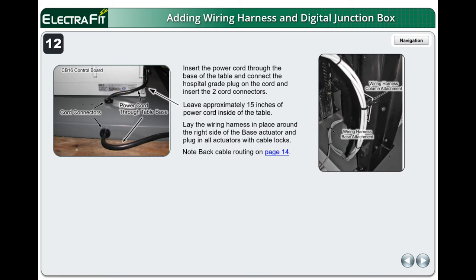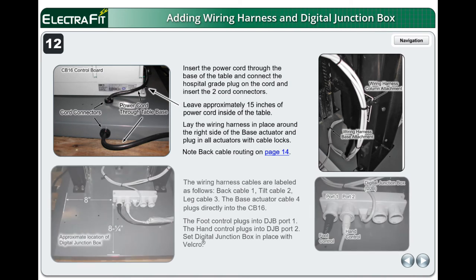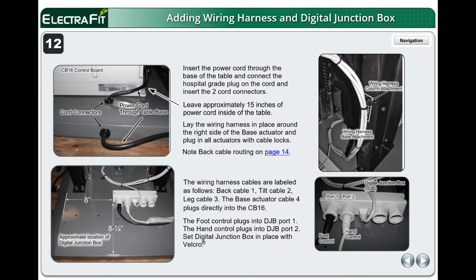Lay the wiring harness in place around the right side of the base actuator and plug in all actuators with cable locks. Note back cable routing on page 14. The wiring harness cables are labeled as follows: back cable 1, tilt cable 2, leg cable 3. The base actuator cable 4 plugs directly into the CB-16. The foot control plugs into DJB port 1. The hand control plugs into DJB port 2. Set the digital junction box in place with Velcro.